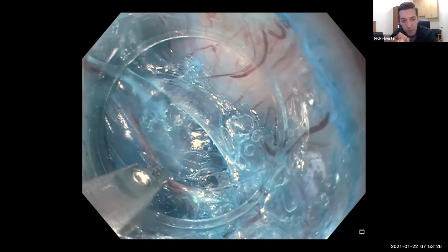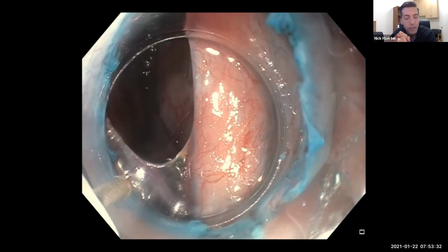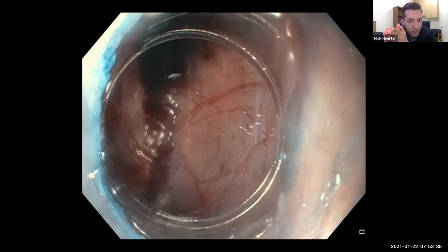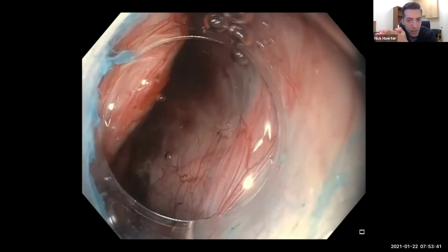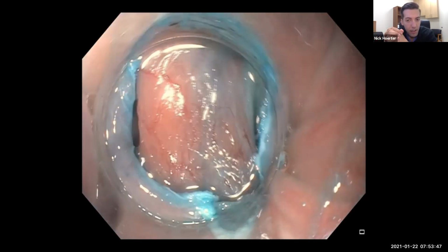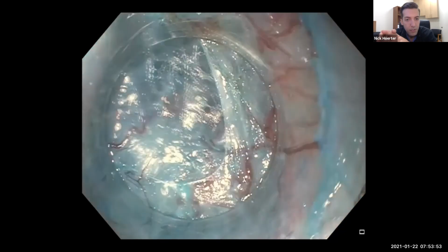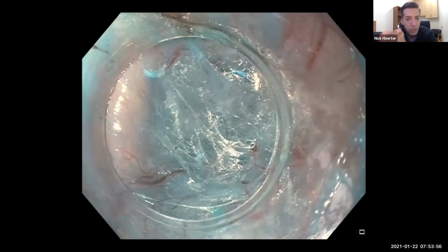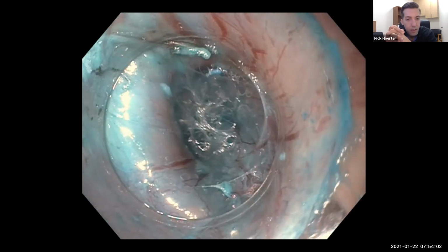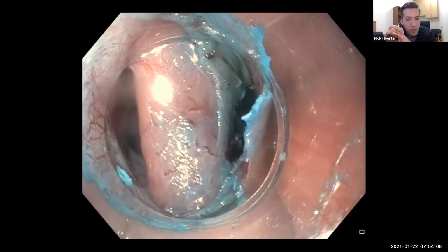The other big enemy of this procedure is bleeding. So anytime we identify a big vessel, as here, we prophylactically cauterize it. So this is pretty much the end of the tunneling. On the left, this is a tunnel adjacent to the muscle on the diverticular side. The muscle's on the right there. And then on the right side is another tunnel on the esophageal side. So we've successfully isolated the cricopharyngeal muscle right in the middle, and that's this big vertical bar right in the middle.